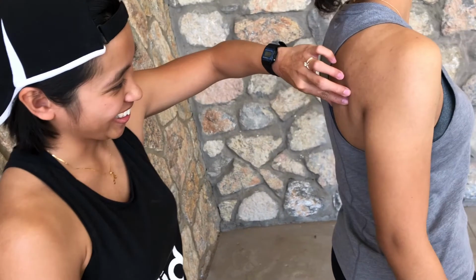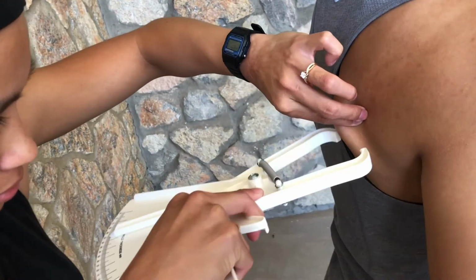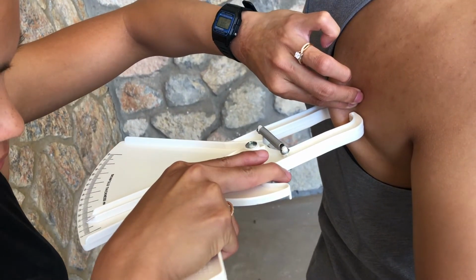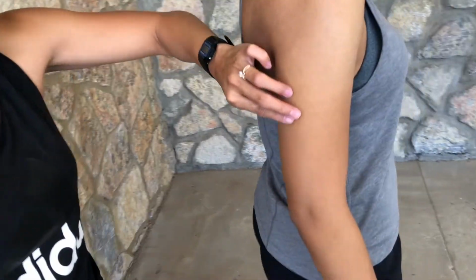The first site we are measuring today is the subscapular measurement, which calls for a diagonal fold at a 45-degree angle 1 to 2 centimeters below the inferior angle of the scapula for 1 to 2 seconds. Determine the amount of subcutaneous fat, which is the fat below the skin of your client, for each site.